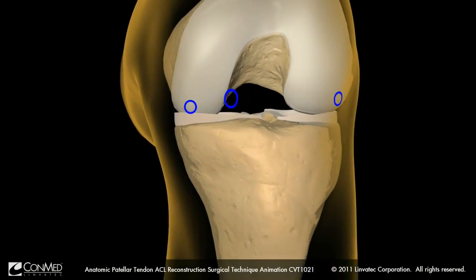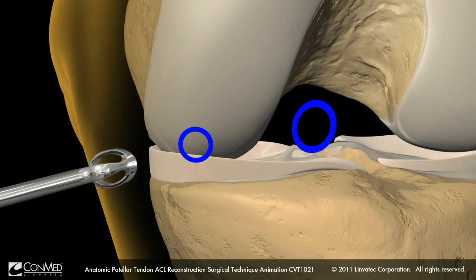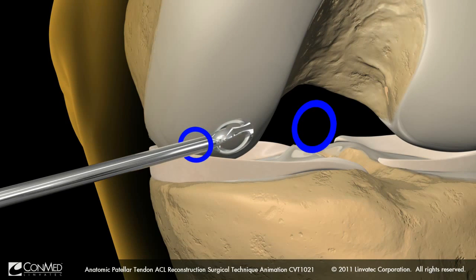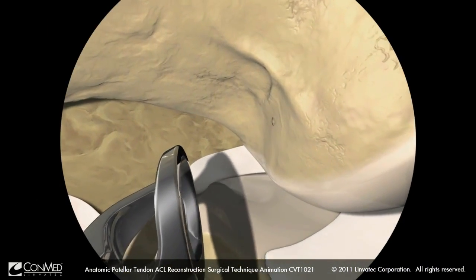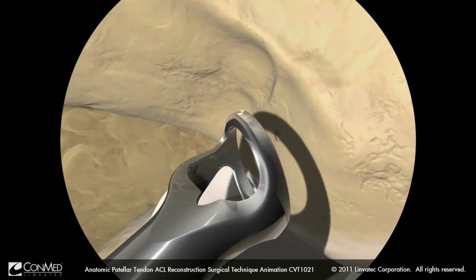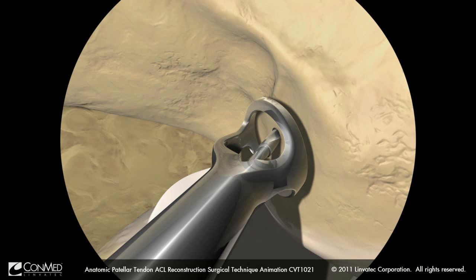With the ACL footprint identified and the center marked, insert the bullseye femoral footprint guide into the AAM portal with the knee flexed at 90 degrees. Place the guide at the center of the ACL footprint. Once the correct position is achieved, advance the exact pin a few millimeters to notch the bone. Back the exact pin out to check that its location correlates to the center of the footprint.